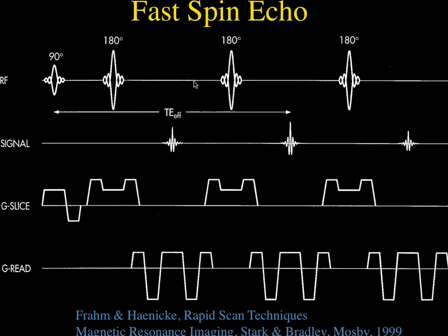There are also some interactions between the spins that are important. Now with fast spin echo imaging, each of these 180-degree pulses keeps things stirred up, so you tend not to lose signal intensity, and fat tends to be brighter.